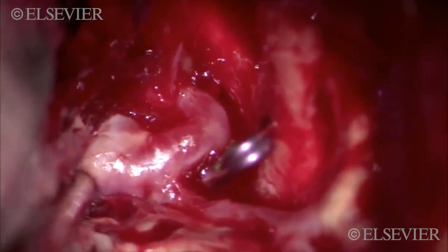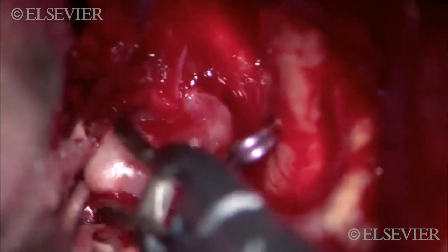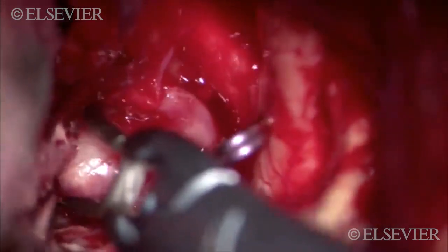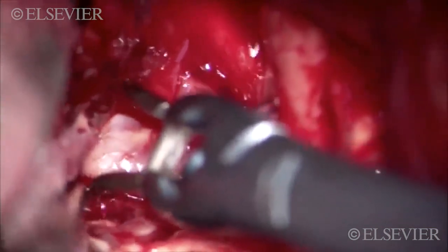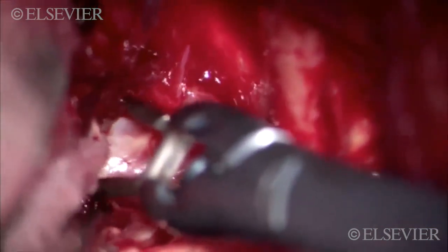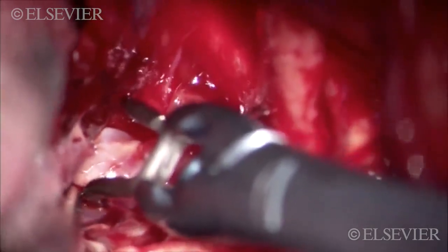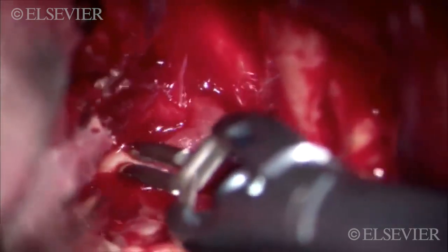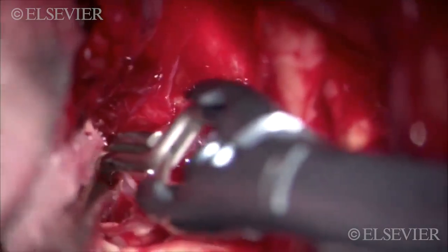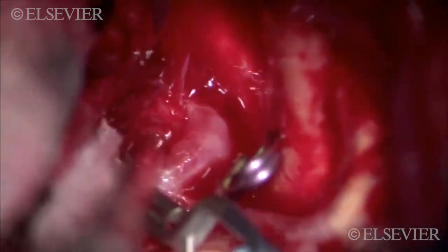So the microsuction is used to control the bleeding point, while a curved clip with the curve going down is introduced on each side of the aneurysm at its origin. And that initial dissection of the aneurysm base is critical here to introduce the clip in a good position. And as you can see, that bleeding point, which was fairly close to the aneurysm neck, has been obliterated.